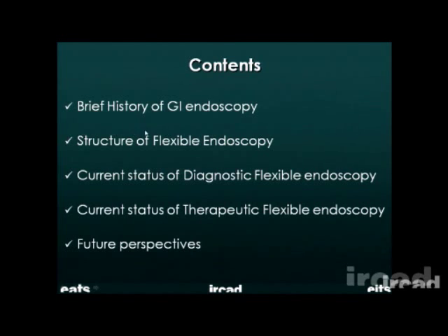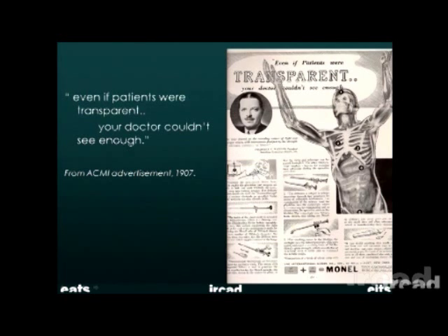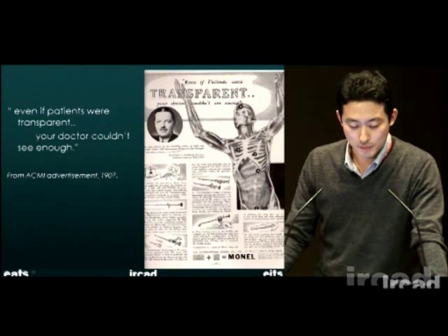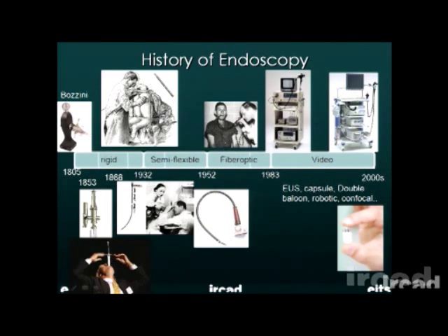Okay, before starting, please see this advertising copy from 1907. "Even if the patient were transparent, your doctor couldn't see enough." I think this copy explains well the need for endoscopy. You may be surprised to hear that Hippocrates examined the gastrointestinal tract around 300 BC. He described examination of the rectum assisted by candlelight.